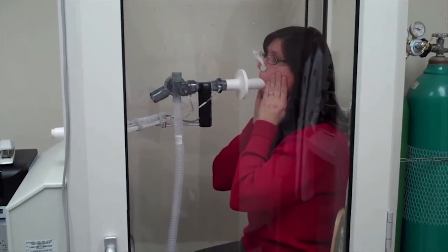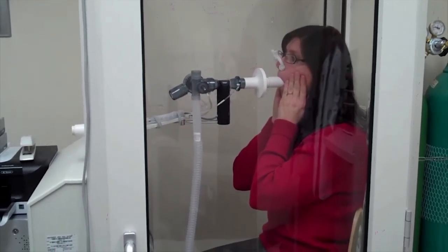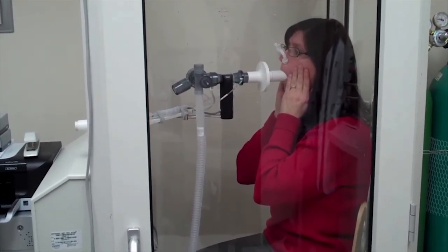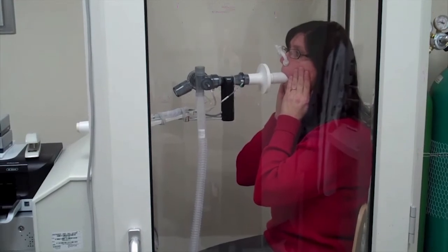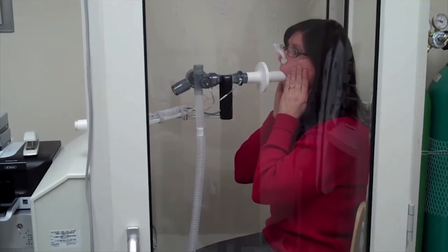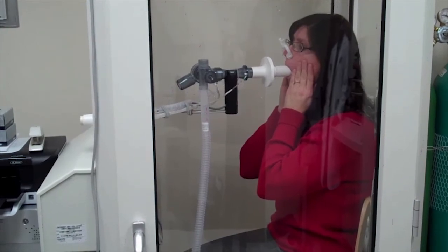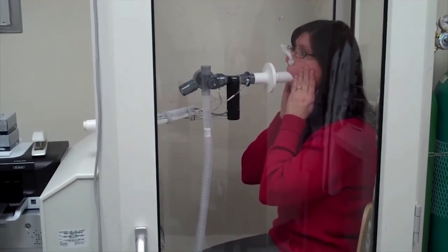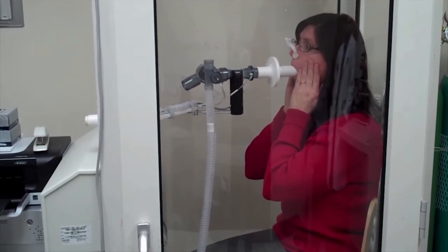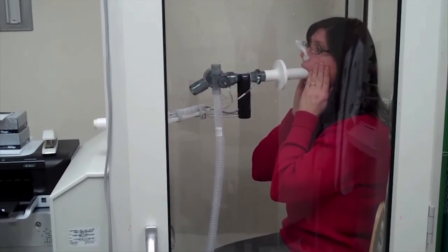Okay, give me a breath in. Blow it out. Blow, blow, blow. Back to normal breathing. Okay, start panting for me. In and out, in and out, in and out. There you go. Keep going. Here comes the resistance. There it is. Keep panting through it. Doing good. Almost done. Okay, you can stop and come off.